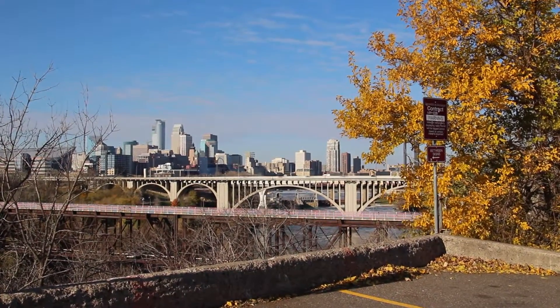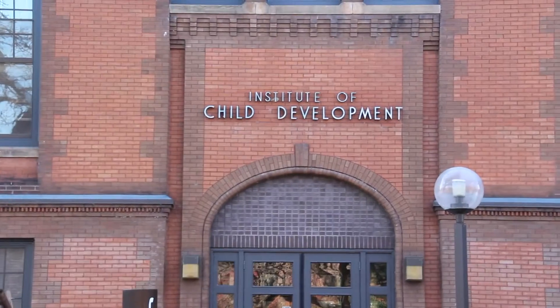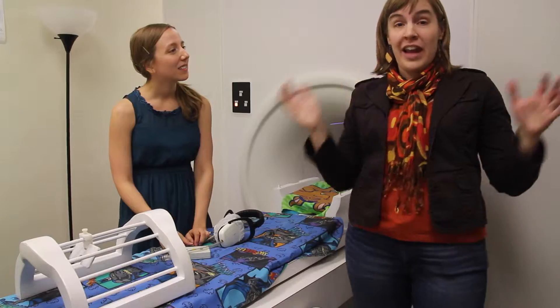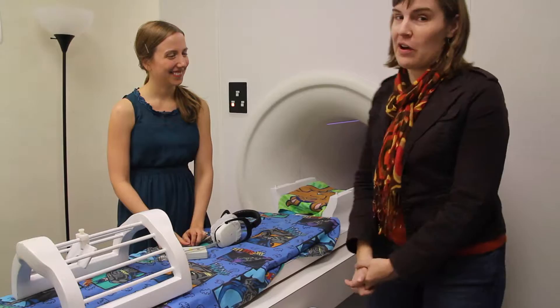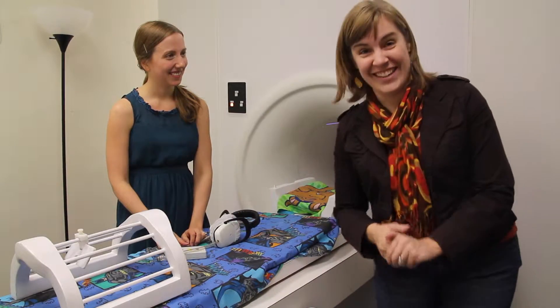A few months back, I visited the Institute of Child Development, my grad school home, to try out a pretend MRI machine while Amanda shared the basics of what it's like to get an MRI. Amanda is going to take me through as if I've never been in an MRI before — she's going to tell me all the stuff that we normally tell people when they're trying out an MRI, and then I get to go in the scanner.